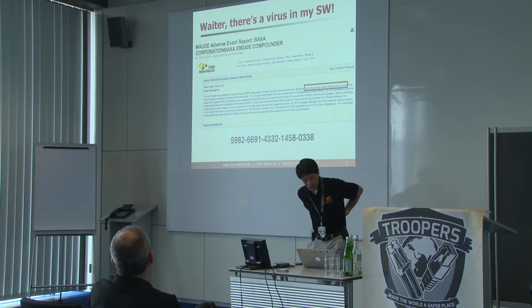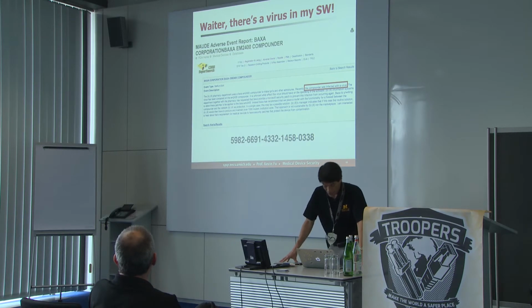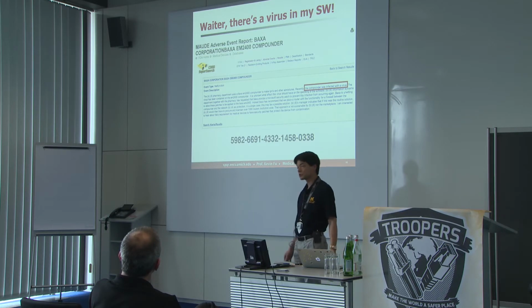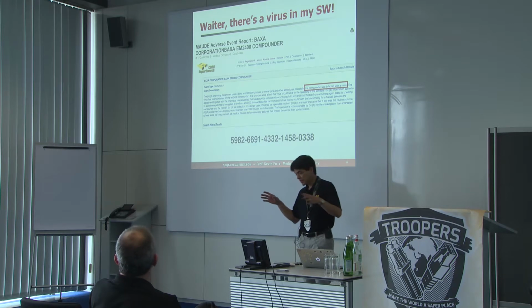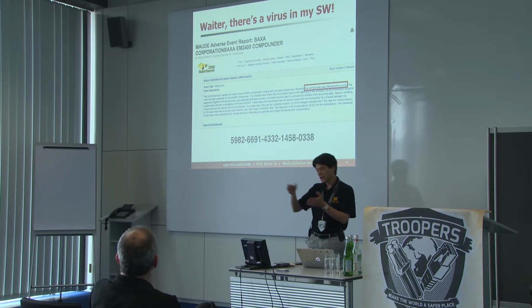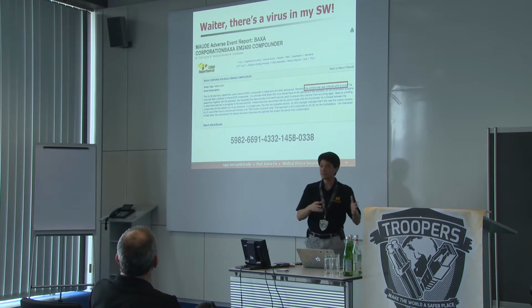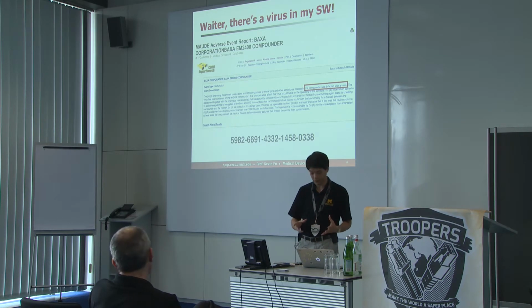I saw an interesting note in the FDA databases about a software update where a compounder was infected with a virus. So a compounder is a pharmaceutical machine. It's a way to make liquid drugs. It takes as input, I think, 16 different vials. We have one of these in my laboratory. You input the highly concentrated drugs on the top, and then you have a saline bag as the output, and that's what you give to the patient to create a custom just-in-time drug delivery.